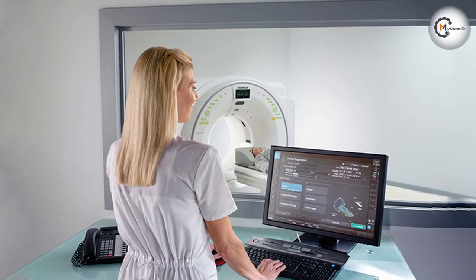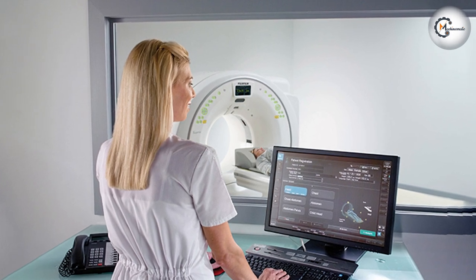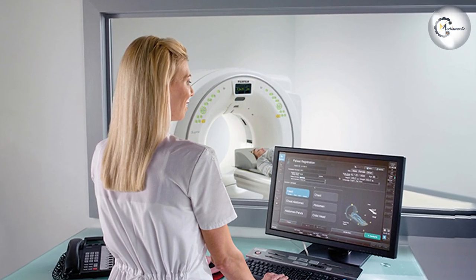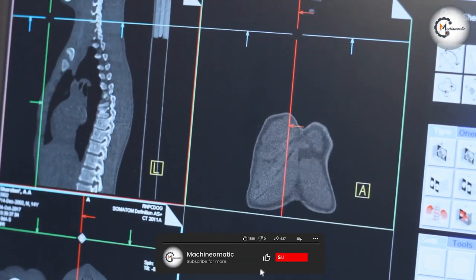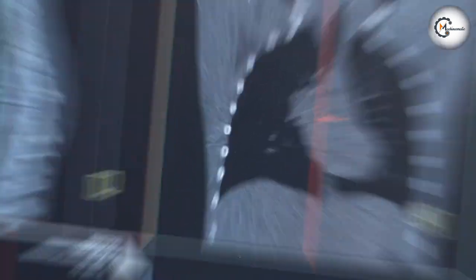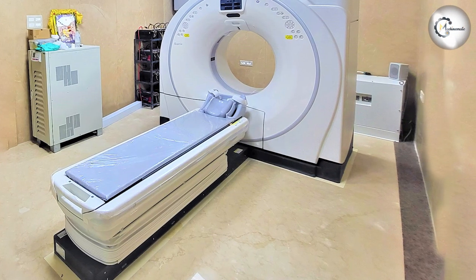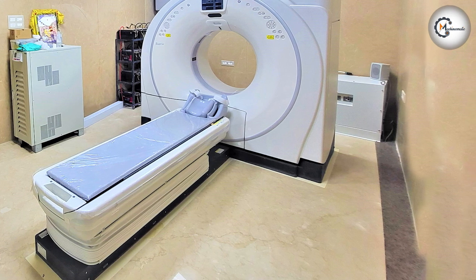The Fujifilm 128 Slice CT Machine is a state-of-the-art computed tomography system designed for high-quality diagnostic imaging. This machine utilizes advanced technology to produce detailed and precise images of the human body. With its impressive 128 Slice configuration, it captures thin slices of data, enabling exceptional image resolution and accuracy.